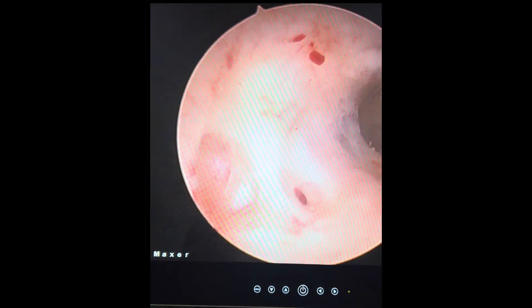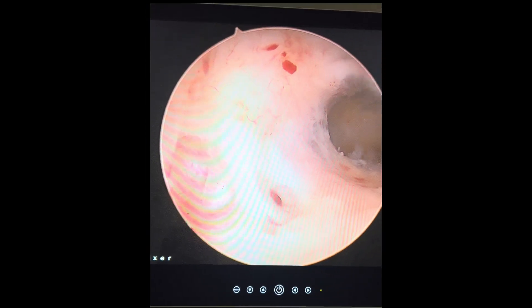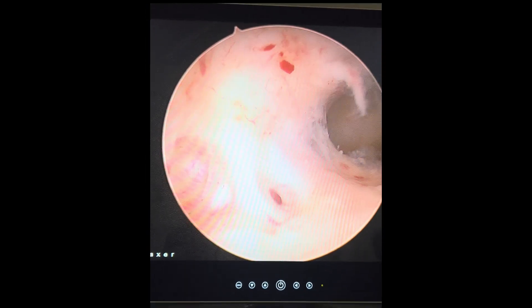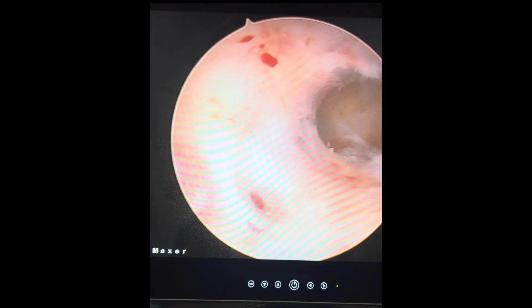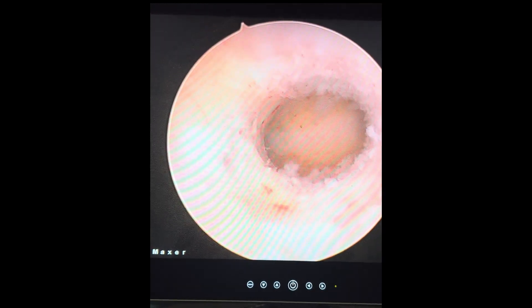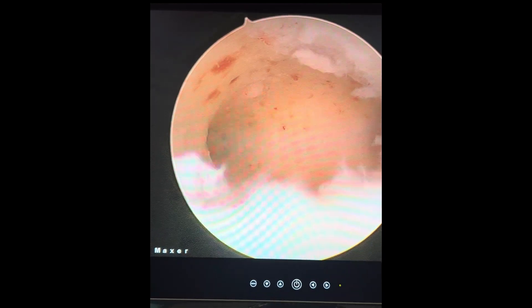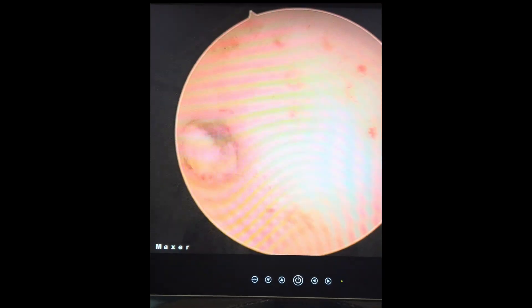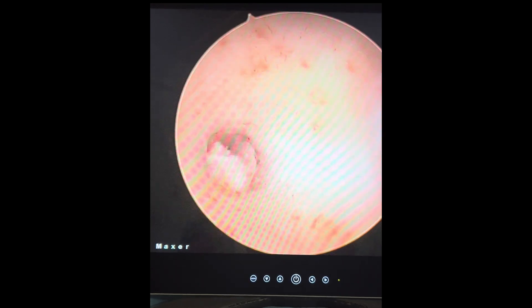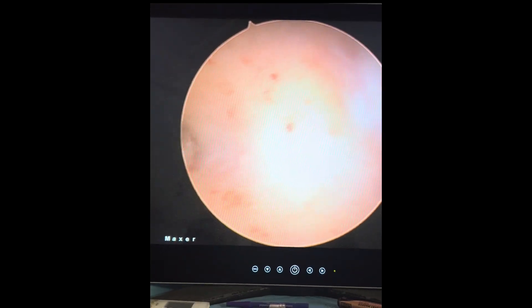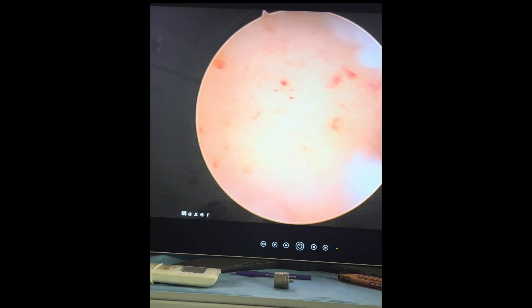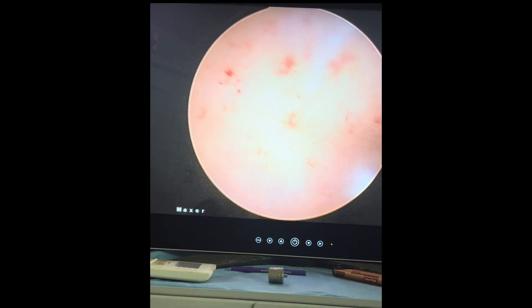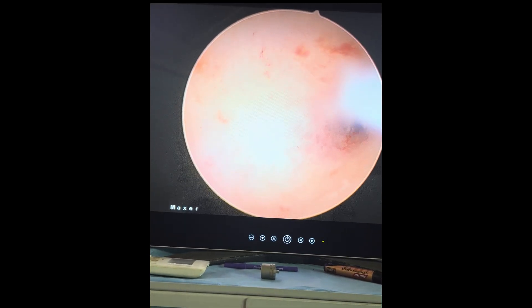Here you can see that on hysteroscopy the uterine cavity looks bald, and there is a cystic lesion in the endometrium. Once we go in, you can see hyperemic spots all around, micro polyps, and also strawberry spots all over the endometrial cavity.